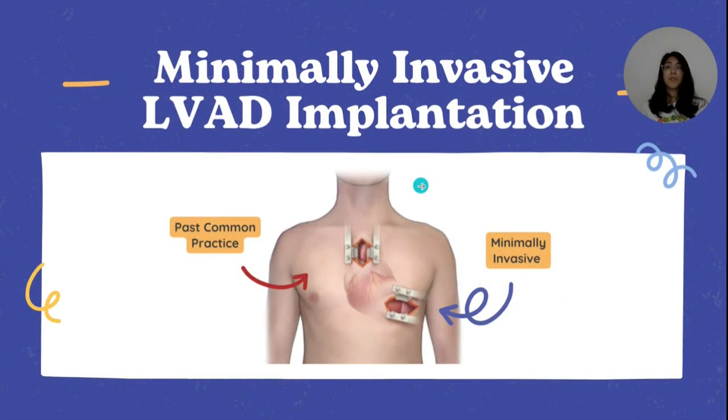Now, here is the minimally invasive LVAD implantation. The past common practice was to break through the sternum to access the heart. However, now with the minimally invasive approach, it is not breaking through bone, only through muscle, giving the patient a faster and more efficient time to recover.